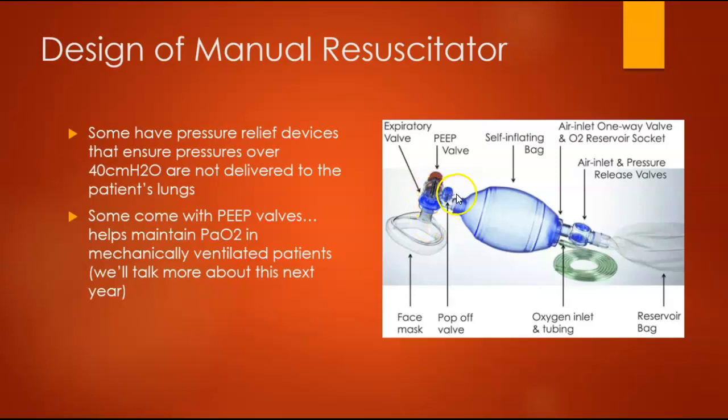Some of these bags have a pop-off valve or a pressure relief valve, which is located here in this picture. This ensures that you're not delivering too much pressure to the patient. So if the pressure inside that bag exceeds 40 centimeters of water pressure, that valve opens up and releases that excess amount of pressure. Okay.